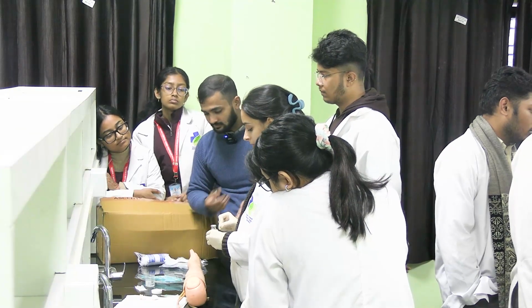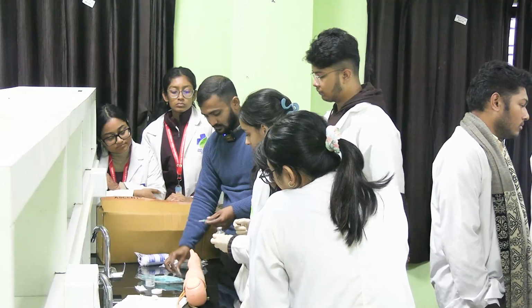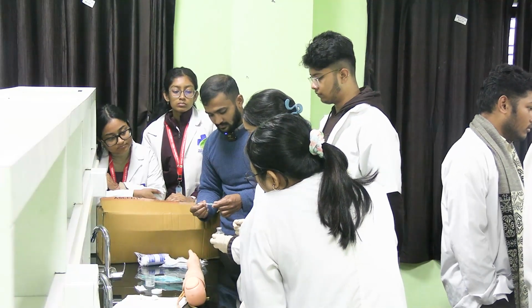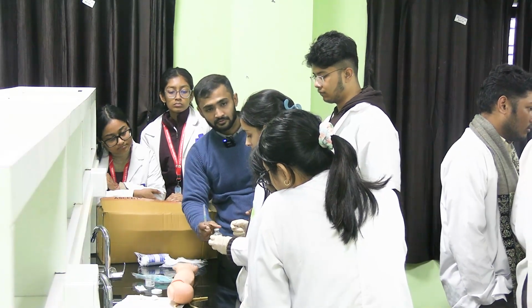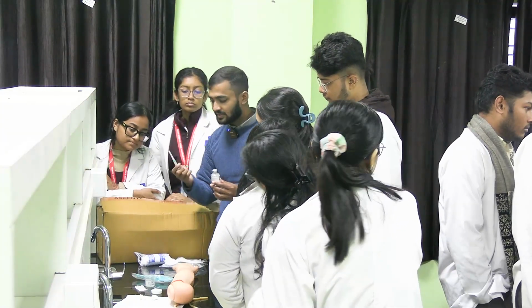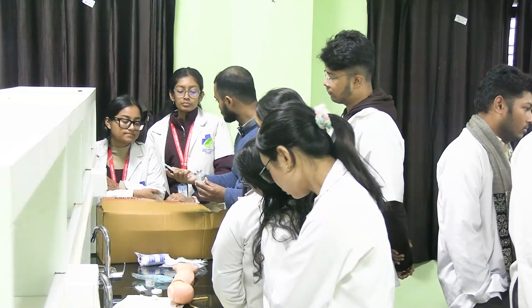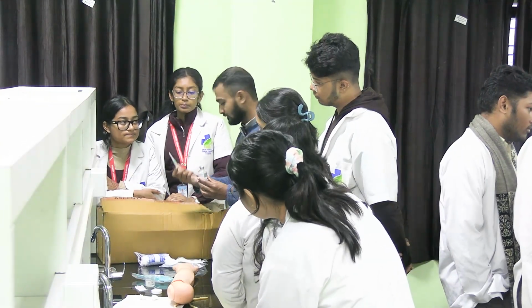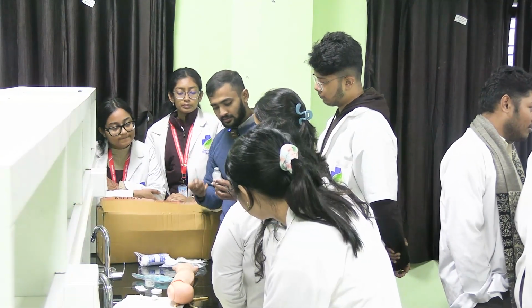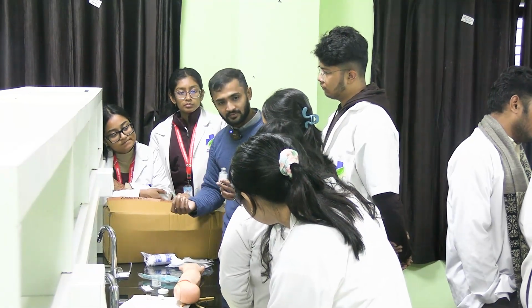Then what is the procedure to take the medicine from the vial? How will you take it, do you know? So you have to take a syringe. Suppose you will be taking 1 ml of the solution. You have to take twice the number, at least 2 ml. Now how will you be taking the solution from the vial? It is a bit different from the ampule.